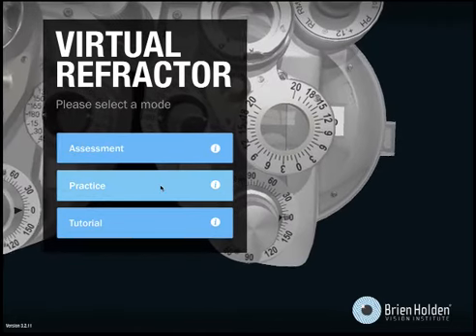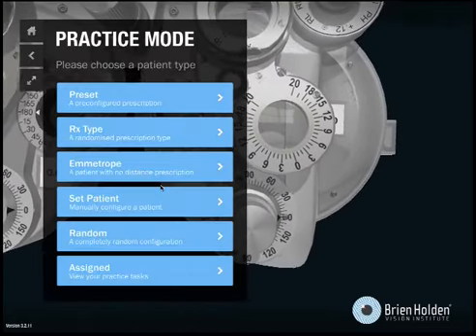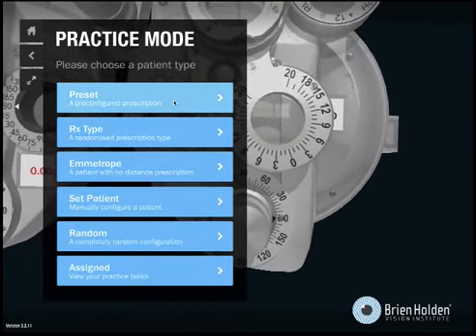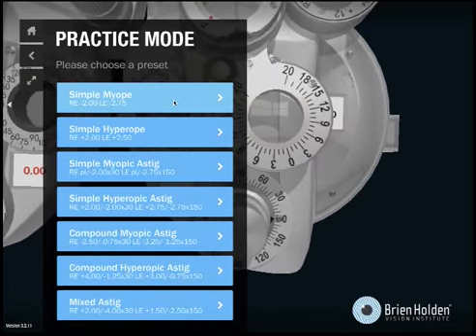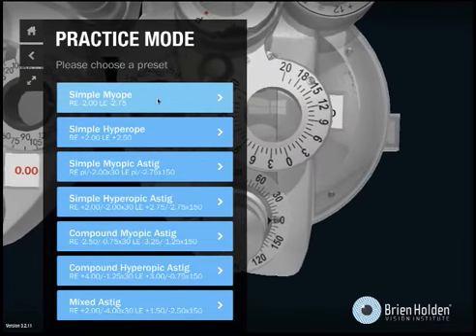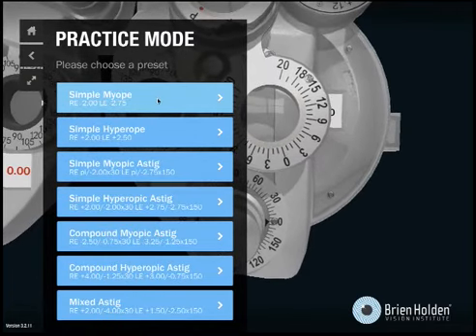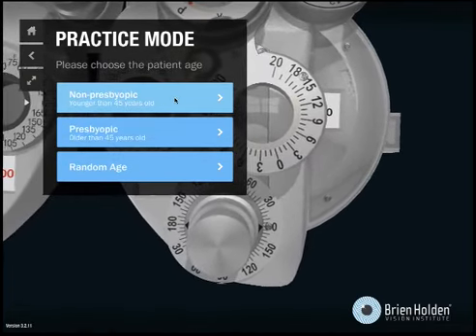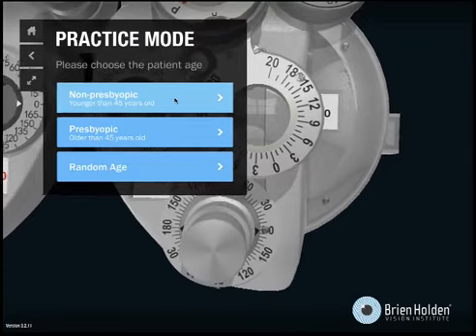I click on Practice and then I will choose an easy patient. I will choose a simple myope — a young simple myope.